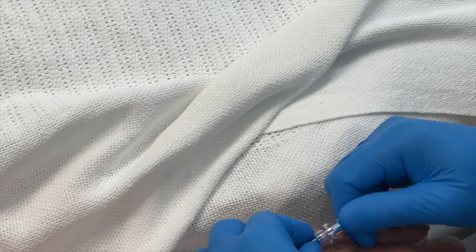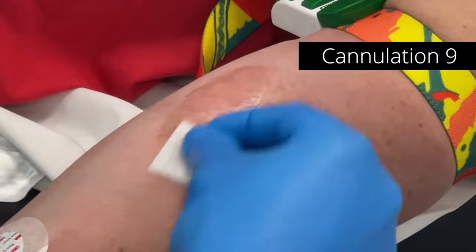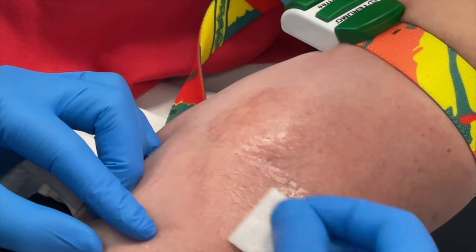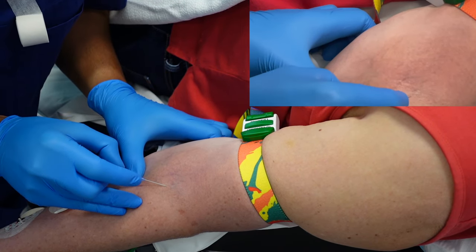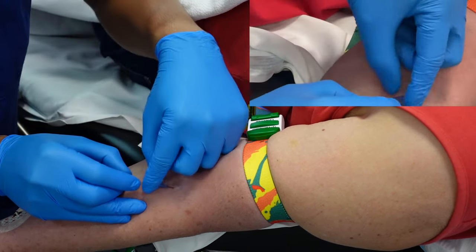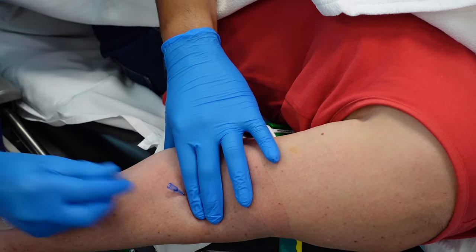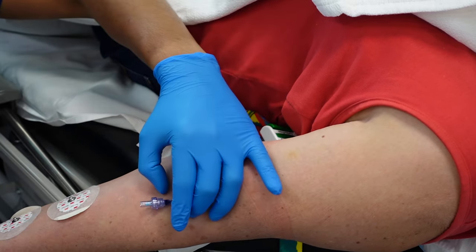I apply pressure proximally, jiggle the bung on, and then transfer my finger only then to screw it on tightly. Here's another cubital fossa vein — not visible but palpable. I swab the area, but then realize I'm not exactly sure where it is, so I retouch and repalpate, but then I have to swab that region again just to make sure I'm using the aseptic non-touch technique philosophy. This is again one of those cannulas I'm really not a fan of — it rotates as I thread it off, it's not stable, and it's not a safety cannula, so the needle isn't protected as it comes out. I threaded the cannula with my left hand, which I don't normally do — usually I thread with my right — but in this case the instability of the cannula made it difficult.